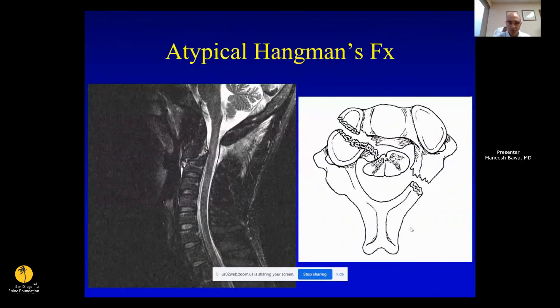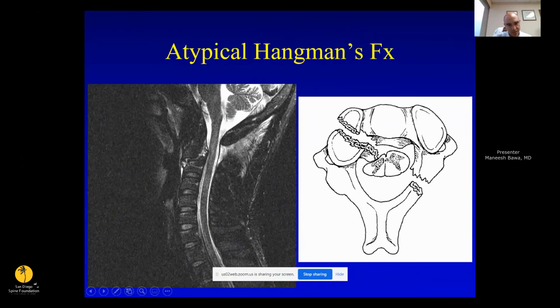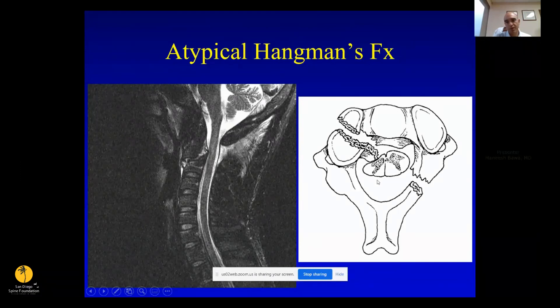There's also an atypical hangman's fracture described by Eismont, where instead of going through the pars, the fracture goes through the posterior body and through the facet joint. On sagittal view you see the posterior aspect of the C2 body involved. These have a higher risk of neurologic injury because as the fracture displaces, that fragment tends to push on the spinal cord. Be careful with these — ensure they're reduced and don't get further displacement while waiting for surgery.